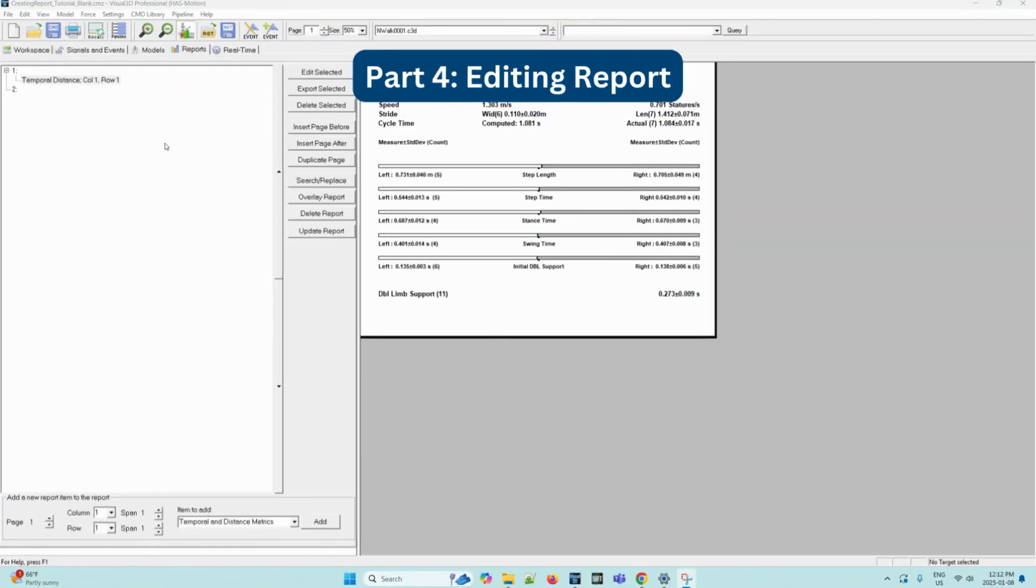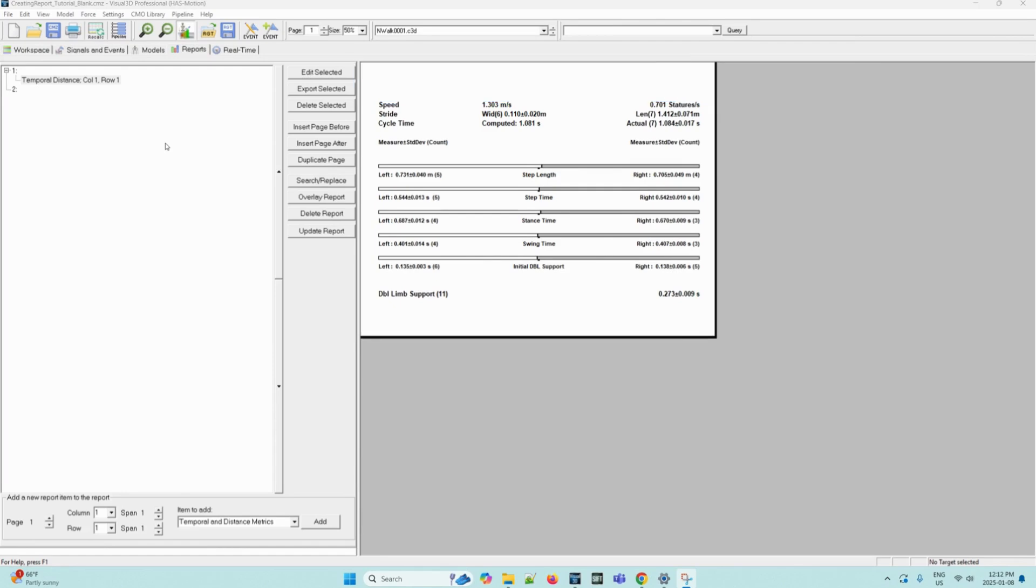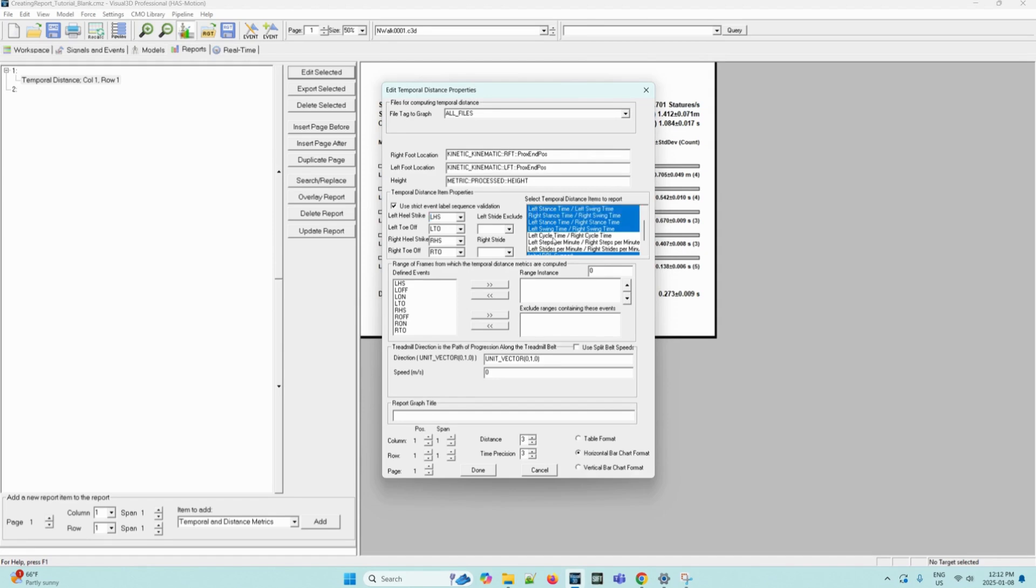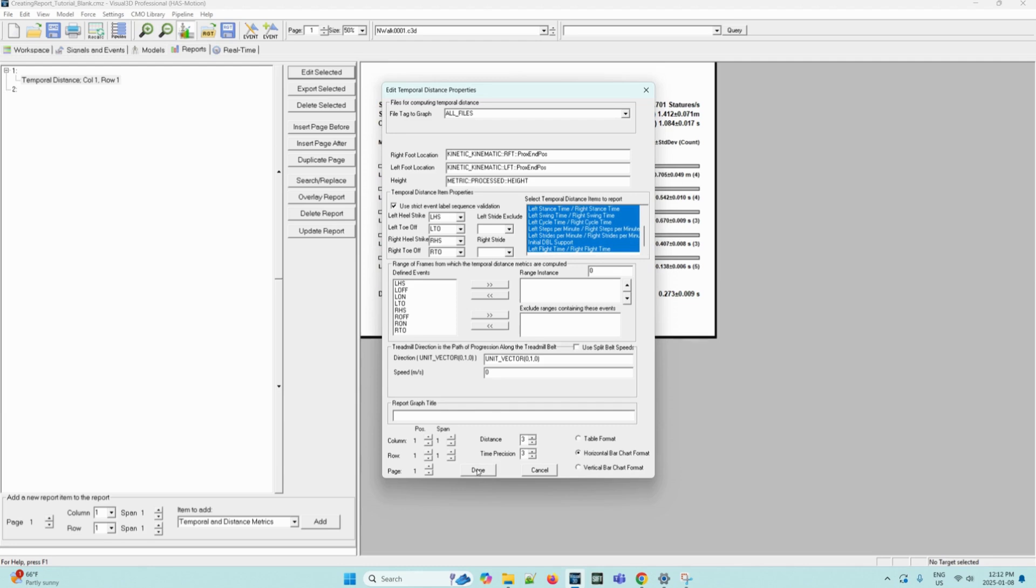Let's say we change our mind about which metrics we want after the report has already been created. We are still able to go back and edit it. So we can select the temporal distance report created by selecting this and then click edit selected. The same dialog box as before will be prompted to show here and we can select more desired metrics. So let's say we want each of the desired metrics in this list to show on our report. We can select all of them and then click done.